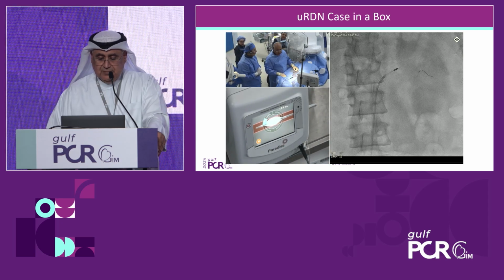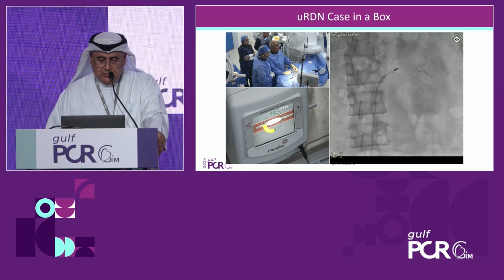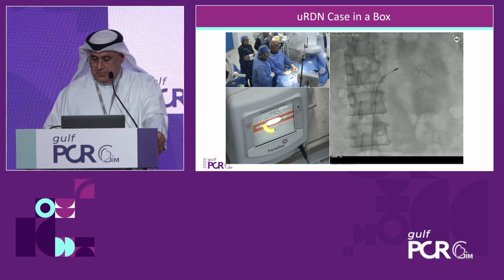Again, we are expecting the patient to move. So this is the pre-cooling phase again. So now it starts, and we'll see the patient. Again, twisting his foot a bit, but it is much better. Really well controlled. Now we'll go to the post-cooling, and then comes the deflating of the balloon. We should take time, not to rush pulling that balloon, and that's it.